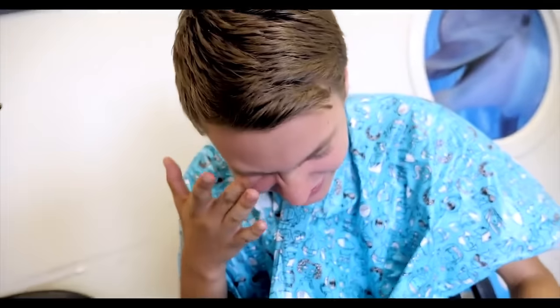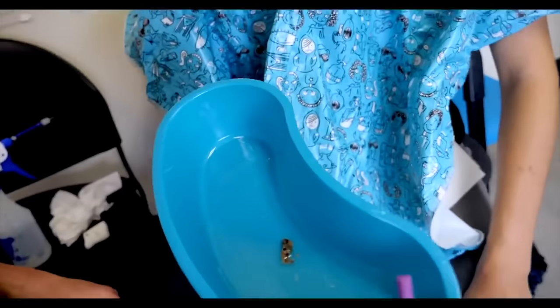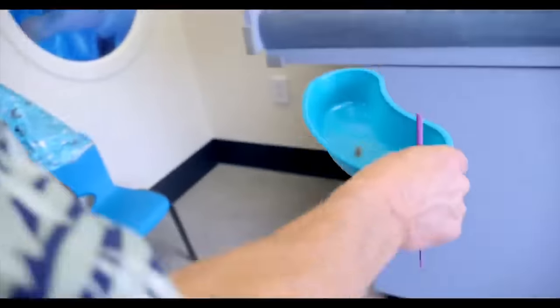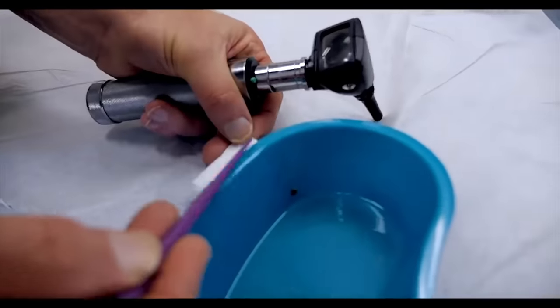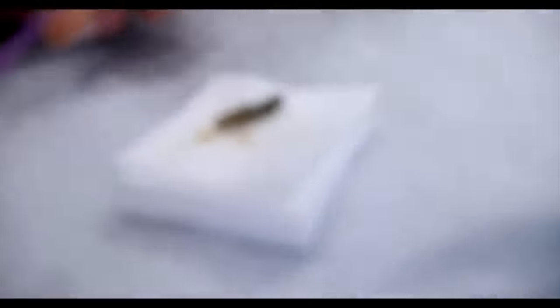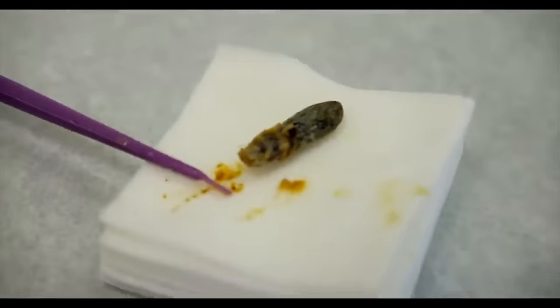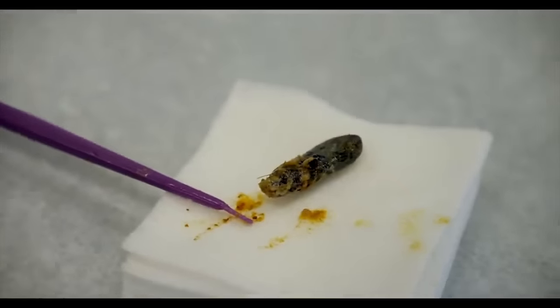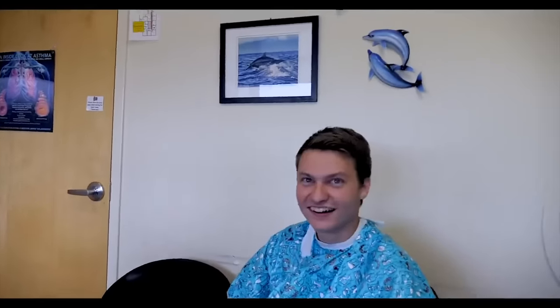That's the granddaddy. Oh, look at that. That is — no wonder you couldn't hear. Isn't that amazing? That's awesome. Put a light on that one more time — bring it out of the water, let's get it to the side. There you go. What are you going to name it, dude? That one needs a name. Oh, your ear's perfect now — totally clear. Is that the biggest single pellet you've ever seen? I think so. That's like the best one we've ever seen — for like a one-piecer? Oh my gosh, it's beautiful.